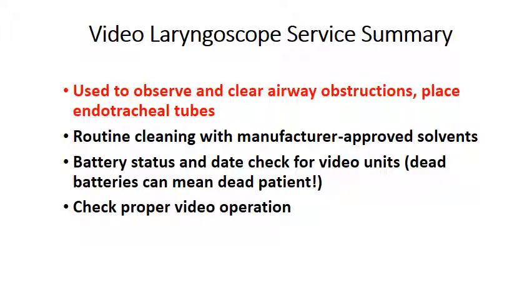They involve routine cleaning with manufacturer-approved solvents. Don't use anything that the manufacturer does not approve. Make sure you do a battery status and date check for video units. A dead battery can mean a dead patient. And check for proper video operation.